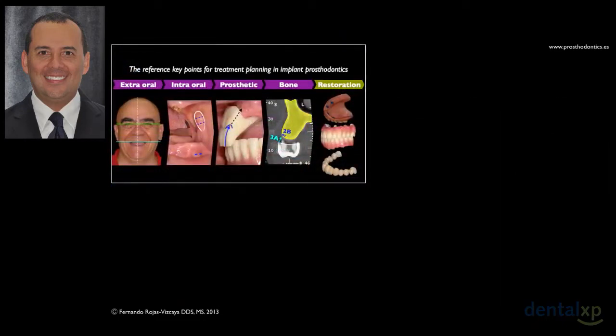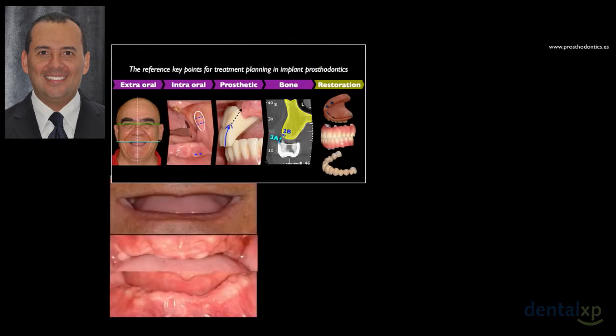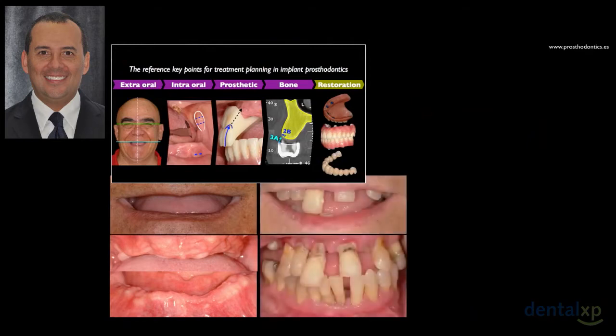So as I told you at the beginning, we will use this sequence in an edentulous patient or in a patient with terminal dentition, where we cannot use any of the points that the existing teeth show, because maybe this is not the perfect incisal edge position, maybe this is not the tip of the canine. So we need to use points that remain stable.